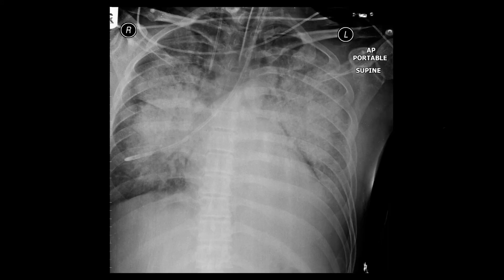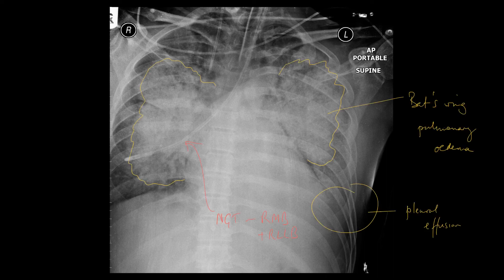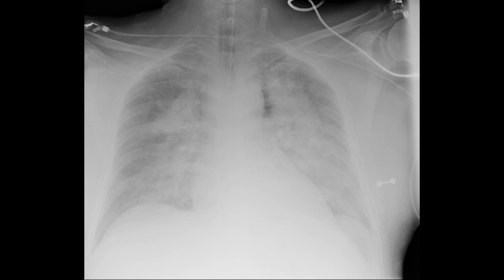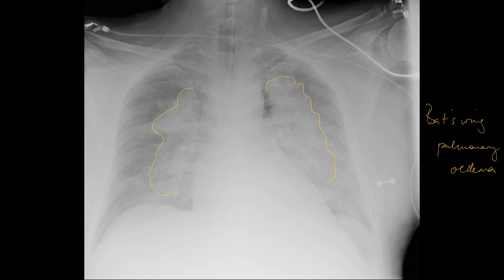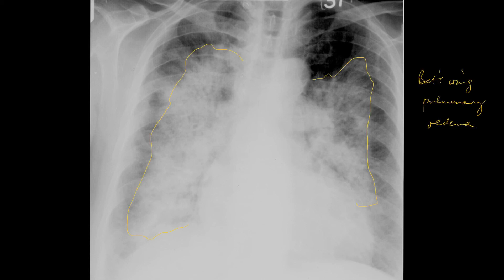Here is another patient on ITU with an ET tube in situ and a right internal jugular line. The NG tube is intubating the right main bronchus and right lower lobe bronchus — that needs to be removed immediately. But there's a very nice demonstration of bilateral perihilar batwing pulmonary oedema with a left pleural effusion. Yet another case of batwing pulmonary oedema — bilateral perihilar airspace shadowing, or so-called batwing pulmonary oedema.